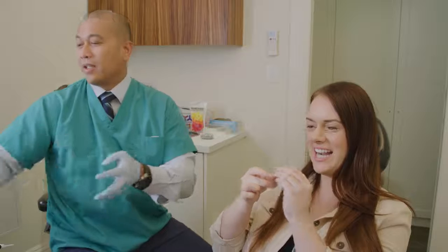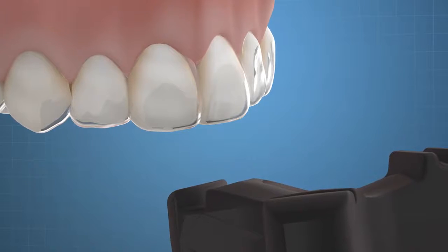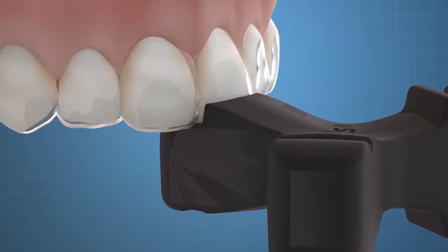Patients should be instructed to insert their clear retainers manually and to use the EPS arm of the device on both sides of the mouth for 30 seconds each. The device is then moved anteriorly, and both the maxillary and mandibular channels are engaged into the retainers for another 30 seconds each.